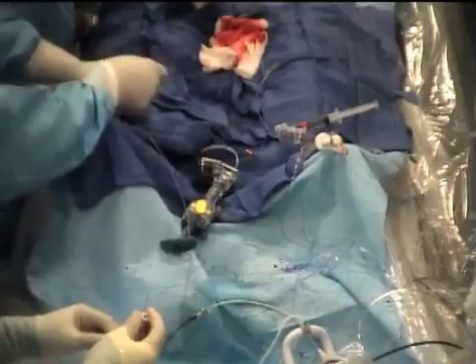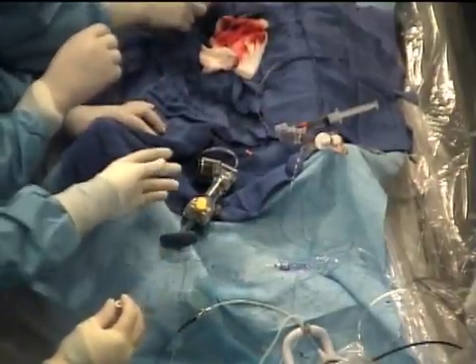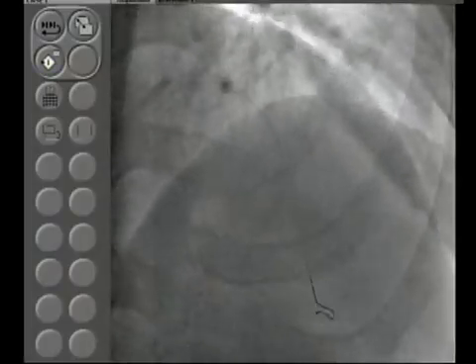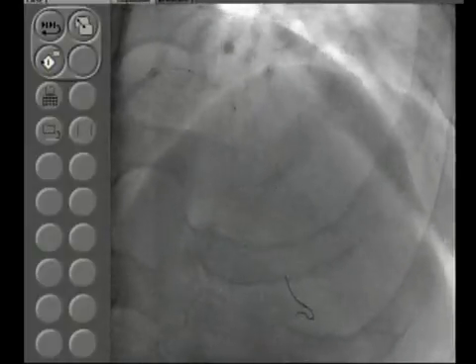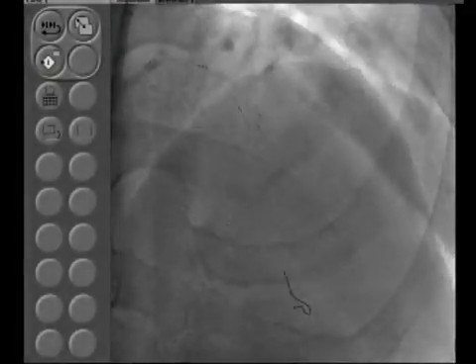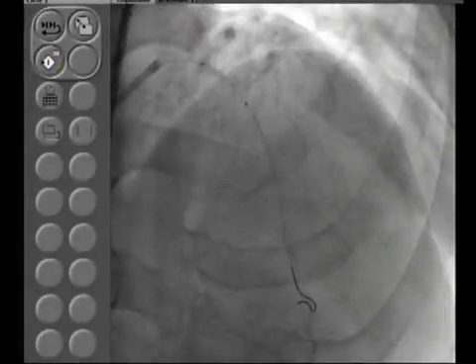Yeah. I mean, that's the whole goal here, that because of such a high calcium, are we going to expand the stent? That is where with the DES, the further decrease in rota occurred, because everybody knew your ultimate goal is the stent expansion, because that is what determines patient's restenosis. So it will be reasonable that in those cases, if you don't expand, then only you use a rotablation, and if you can crack the lesion even with the high pressure, it's perfectly fine.